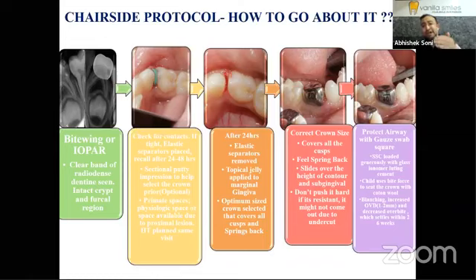Make sure that when the crown is seated, the occlusogingival dimension is also taken care of, because at times the cervical region remains open, and that will be the region where your secondary cavities may form. If you see over here in the fourth image, D5 was slightly short of going subgingival. That's when we shifted to D6 after adequately crimping the D6 crown.